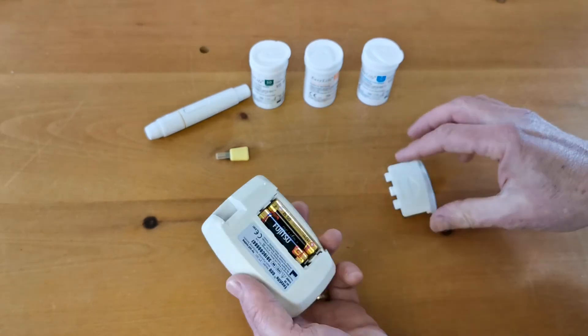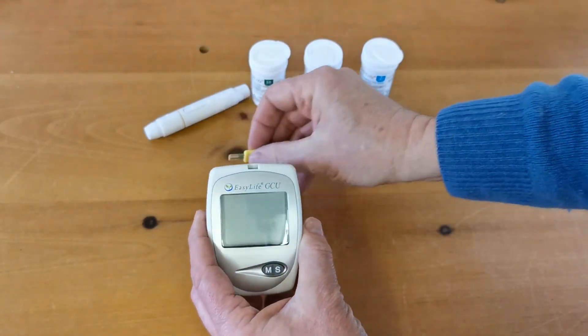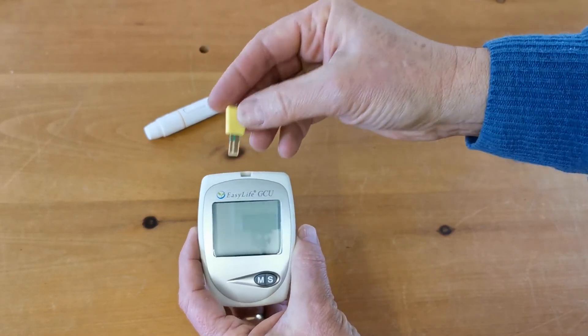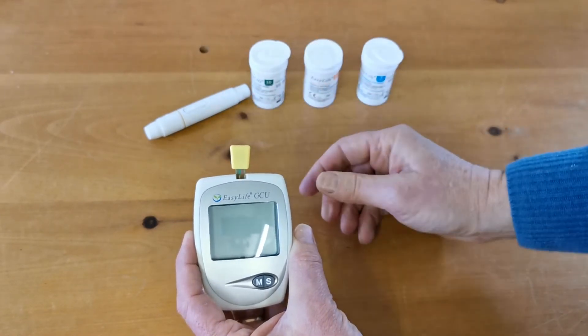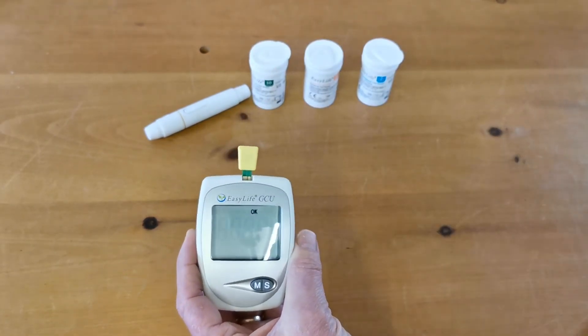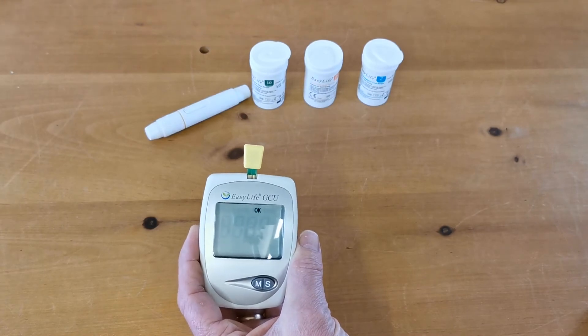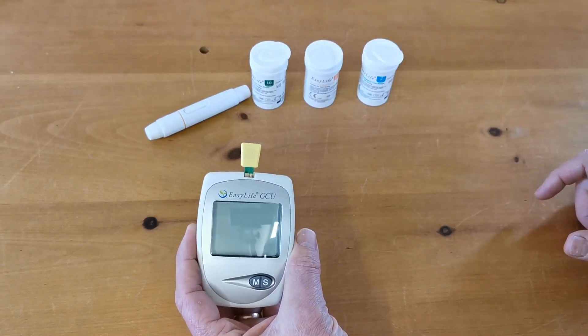Once you've done that successfully, put the battery compartment back in and insert the yellow test code chip that's supplied with the meter. What we should see, if we get this in correctly, is the OK symbol coming up. There is a correct rotation on that chip — one way it didn't work.